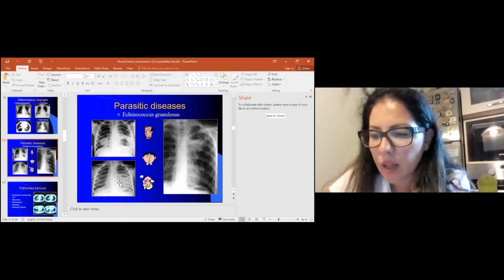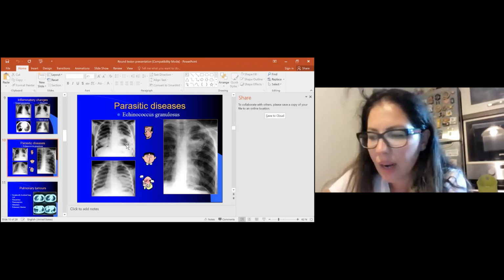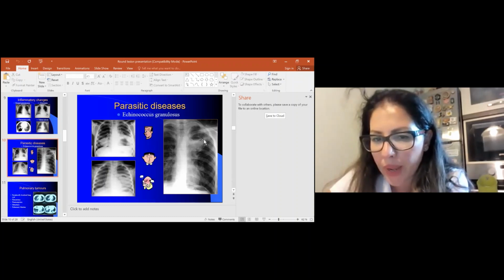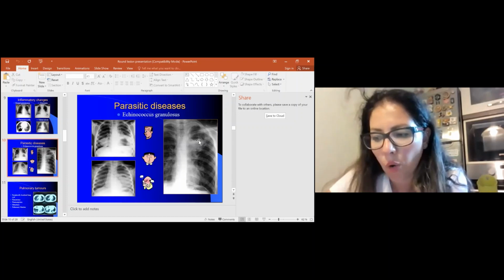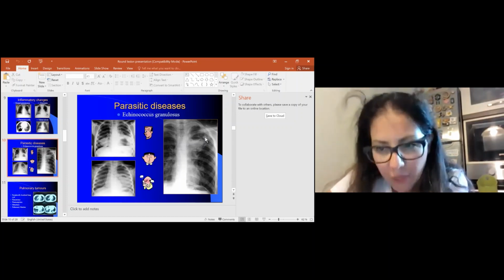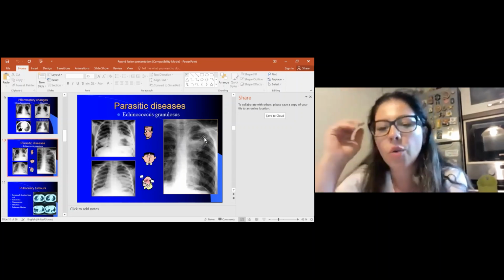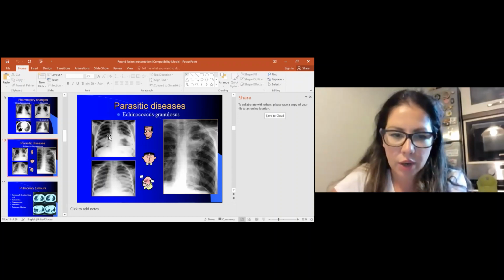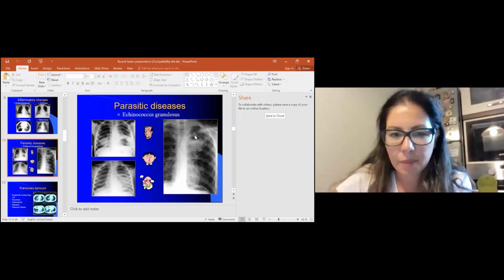peripneumocyst sign. If the cyst perforates, it can appear as a hydroaeric level, which is not flat but wavy, like in this picture, due to the germinative membrane of the daughter cyst, which is called the sign of Camalote, and it's very pathognomonic for these types of complicated parasitic disease or complicated Echinococcus granulosus. Like this is simple and complicated cyst.